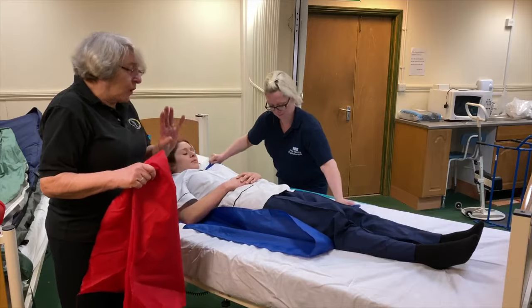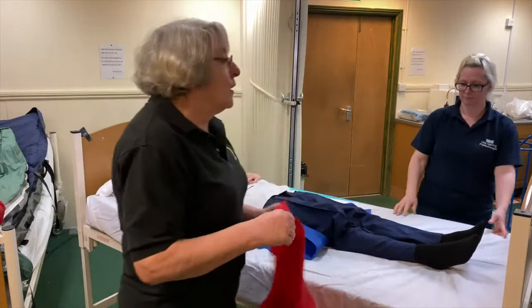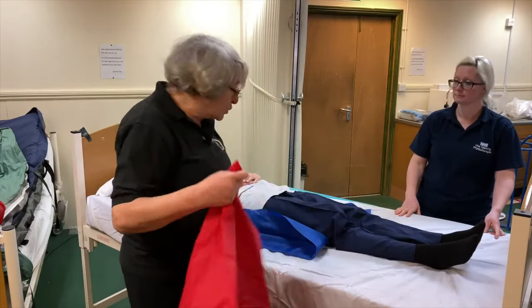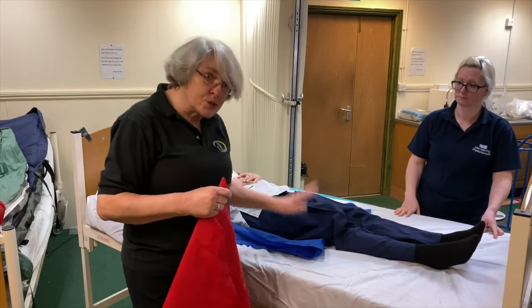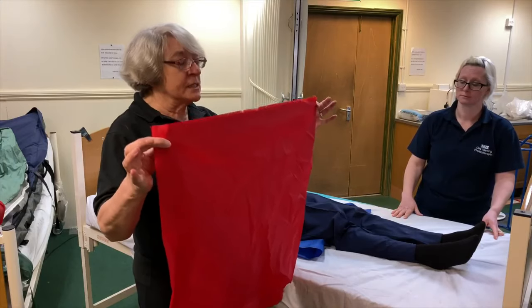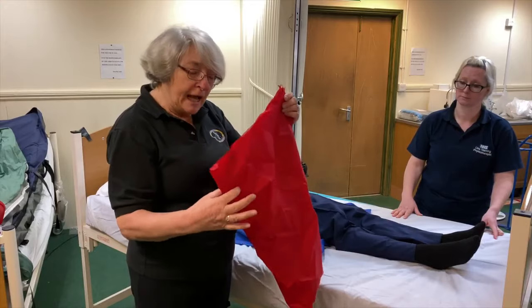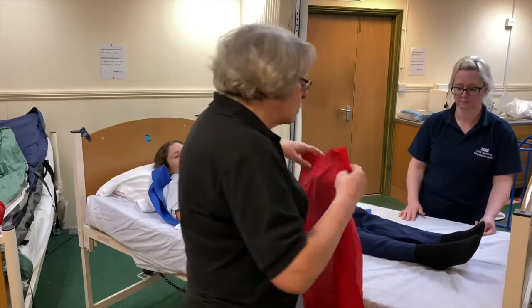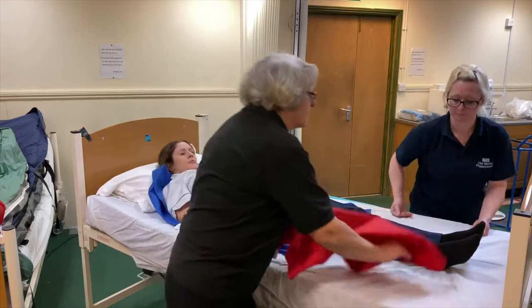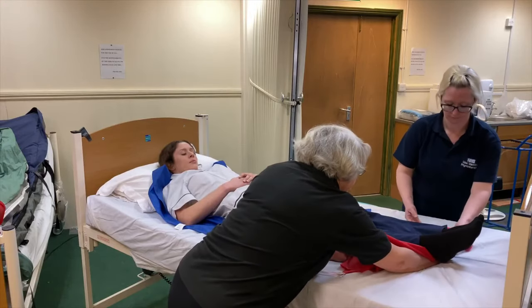So we have only 3/4. We do have to think about the vulnerable heels. So we're going to get a smaller one. This is a smaller one. If you've only got two that size, then use two that size. But if you've got a smaller one, a way that you can insert this is to take it, fold it in half, and have the folded end going towards the heels. I'm going to come at an angle to do this, and so you can see, I'm going to push that under there like that.